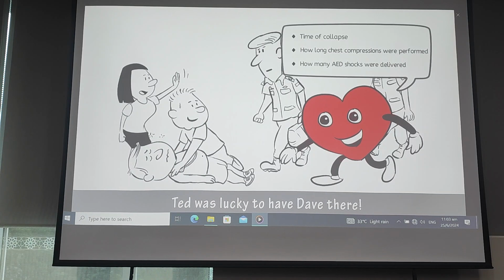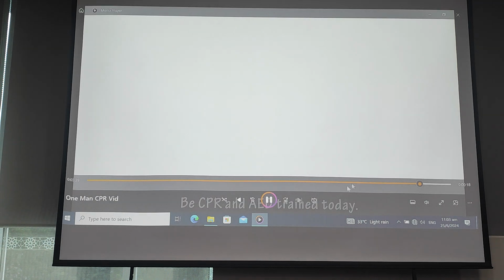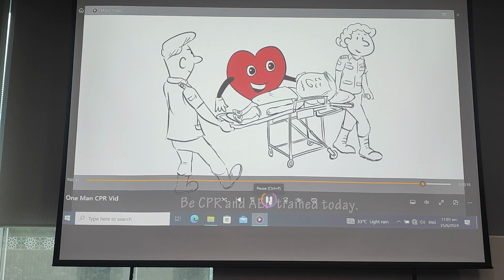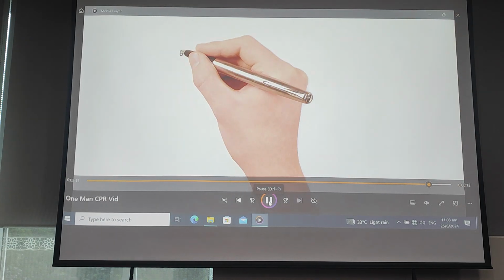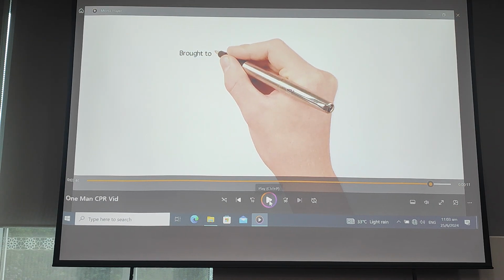Ted was lucky to have Dave there. Be CPR and AED trained today. You have the power to save lives.